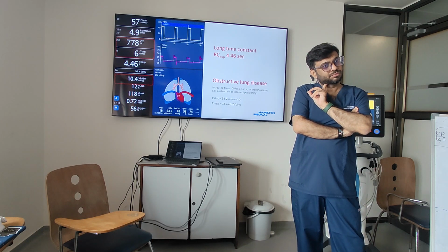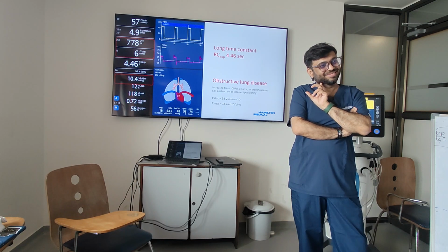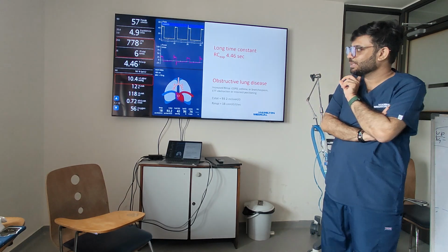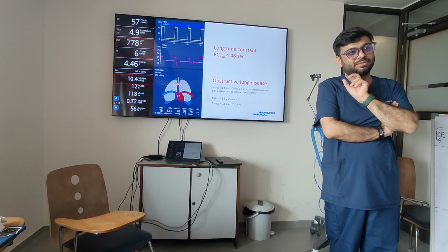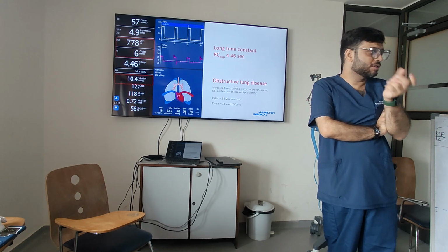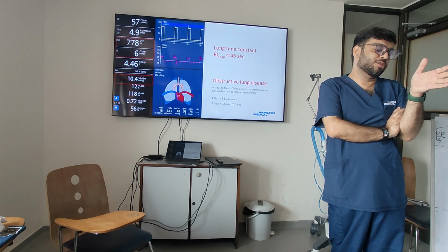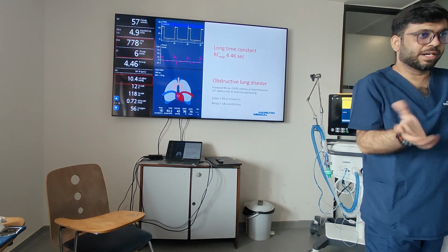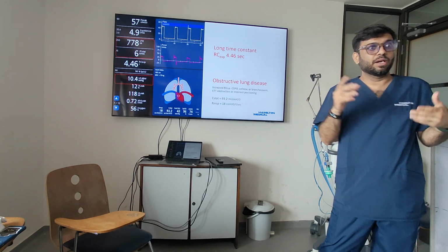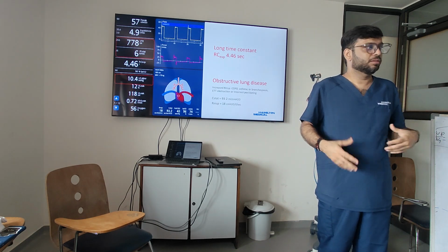It's very difficult to digest. It goes to 800, 900 also. But how much does the guideline say for COPD, like you said? I really don't know for COPD. The guideline says 6 to 8 ml per kg for a normal patient. So 8 ml is acceptable. Anything where the lung mechanics are much worse, as in more obstruction, remember this.